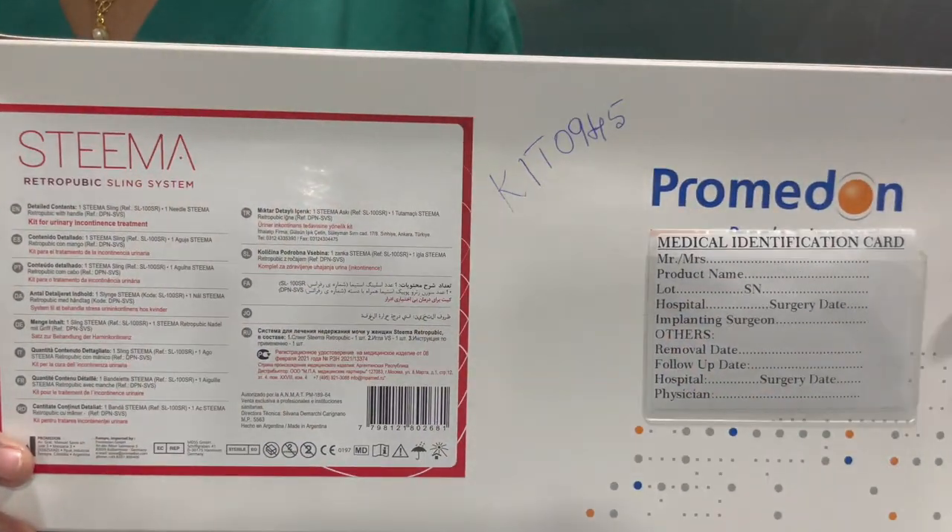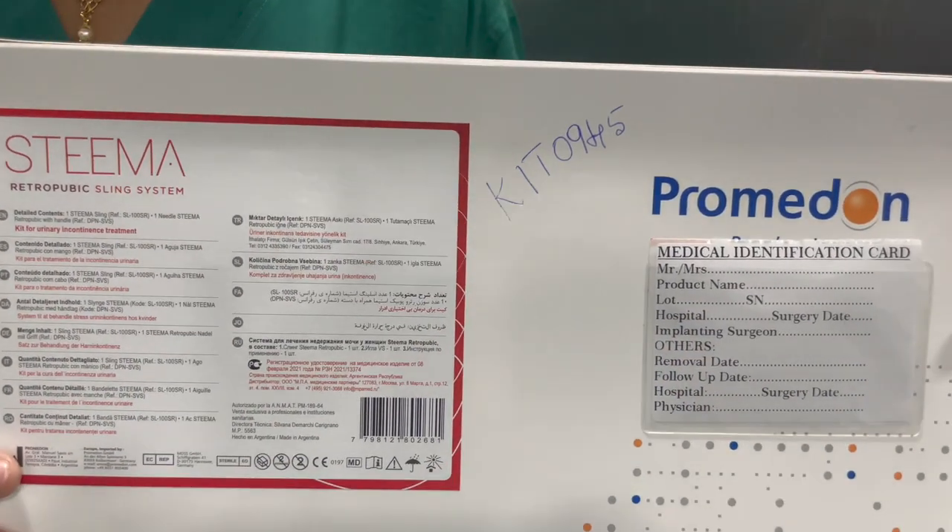The company is Promedon and the set is called STEMA, the retropubic sling system.